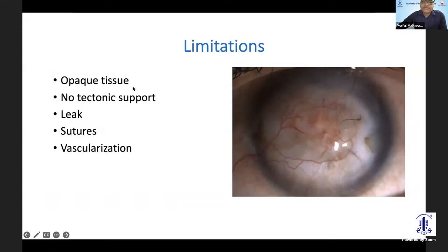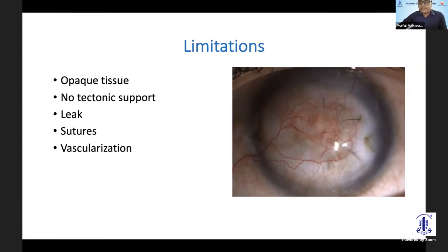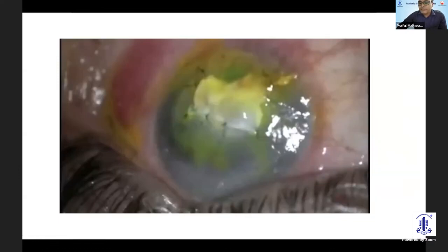Limitations: it's an opaque tissue, so if you're doing it in a central corneal perforation, the patient won't be rehabilitated visually — you have to do a secondary graft. It doesn't have any tectonic support. Cyanoacrylate glue gives you some tectonic support but tenon's patch does not. If you are doing it in a large perforation, you have to supplement with glue. Sutures are a big problem in an acutely inflamed eye, and it does induce some vascularization — not as severe as cyanoacrylate glue, but present.